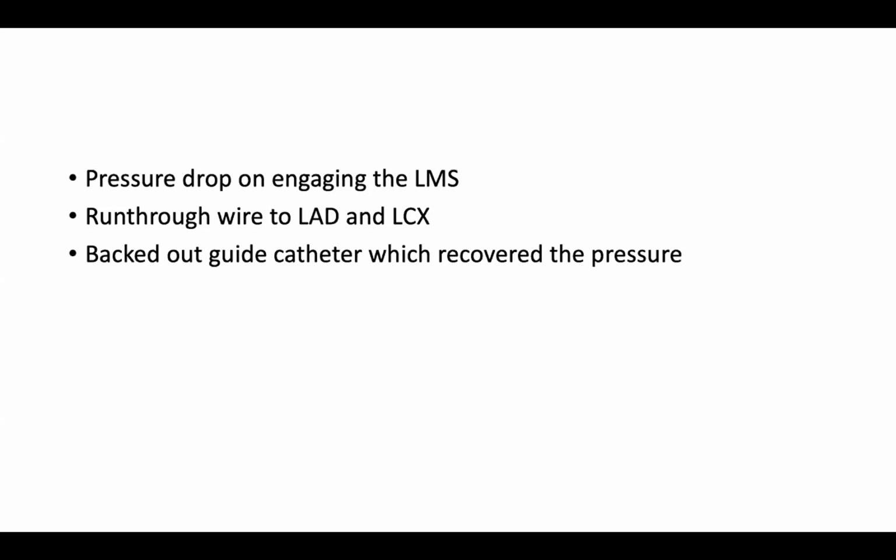Yeah, I think let's proceed, but I agree with what Tariq and other people are saying, that at this stage the patient is in shock and there is TIMI 3 flow with possibly a lesion in it. You should keep other options in your mind. Absolutely right. Definitely. Okay, in the interest of time, carry on with the case now. So we went ahead and did an IVUS study of the left main.